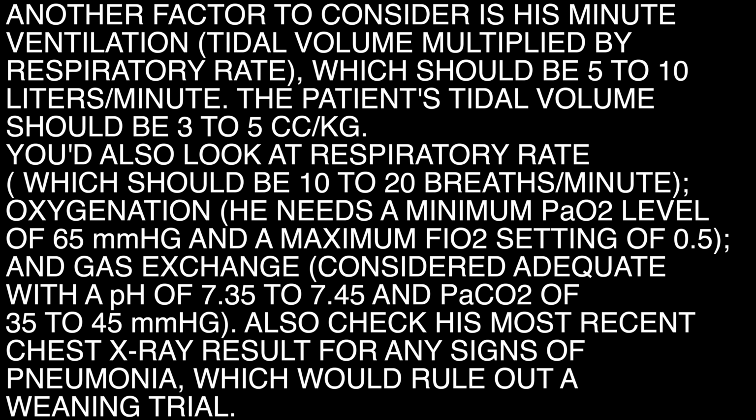Another factor to consider is his minute ventilation, tidal volume multiplied by respiratory rate, which should be 5 to 10 liters per minute. The patient's tidal volume should be 3 to 5 cc per kilogram. You'd also look at respiratory rate, which should be 10 to 20 breaths per minute.